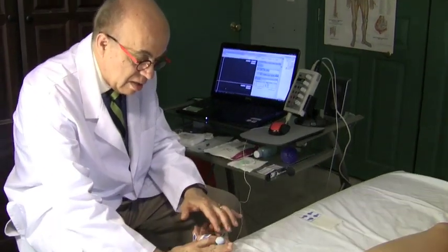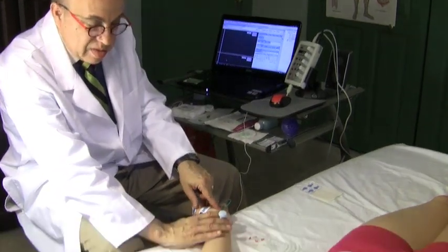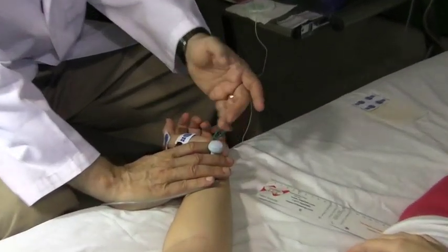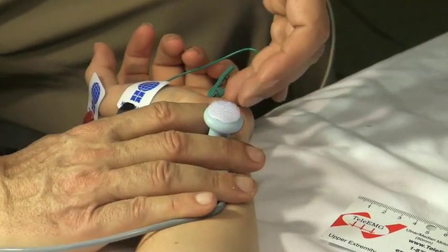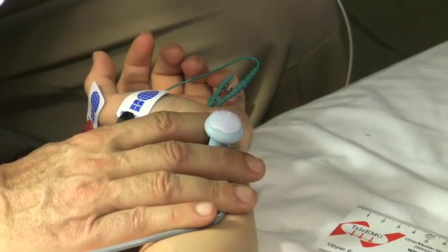Now I'm going to stimulate the median nerve at the wrist for the F wave. I don't change anything. I just put the stimulator like this. I leave the electrode exactly where they are. And as I said, the electricity now is going up and going down, but I'm going to analyze what went up this time.